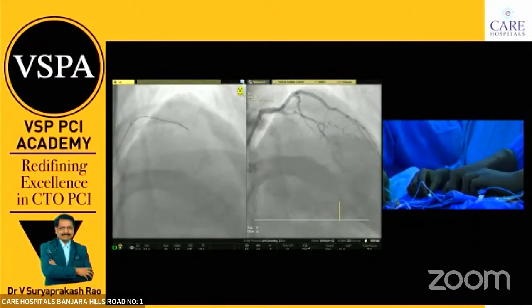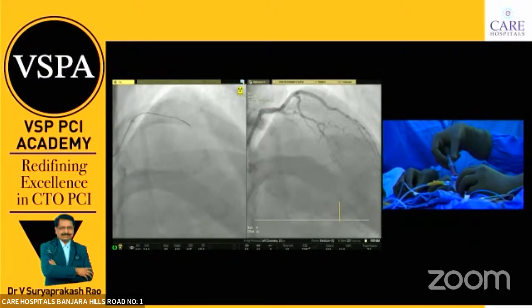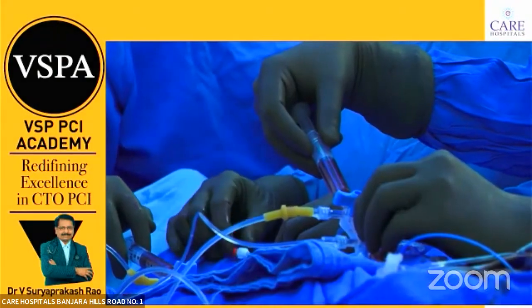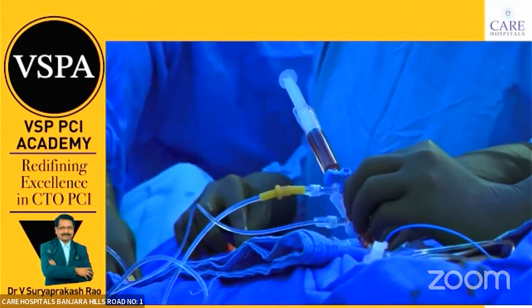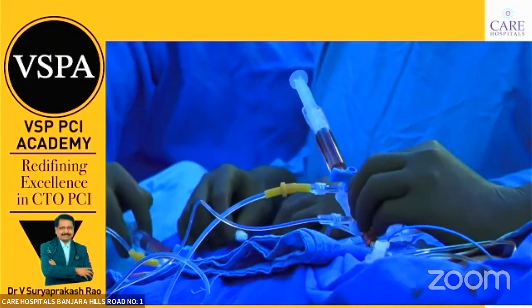When I am crossing, I'm cautious. Remember, if the first attempt wire crossing is successful, usually CTO PCI is successful. That's very important. Now always take the microcatheter to the tip of the wire. That is important for support, because it centralizes your wire for penetrating the cap. This is the secret.